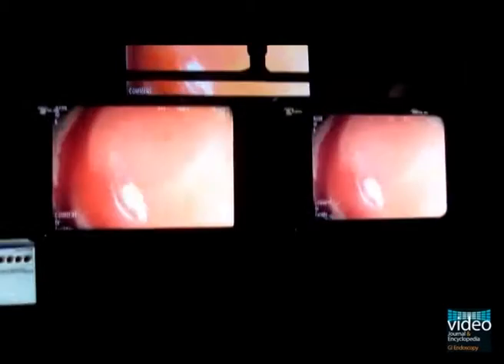This is the standard setting during endomicroscopy. While one set of monitors displays the standard white light imaging, the confocal laser microscopy tower picks up the in-depth mucosal imaging.